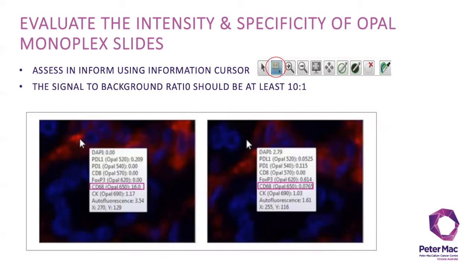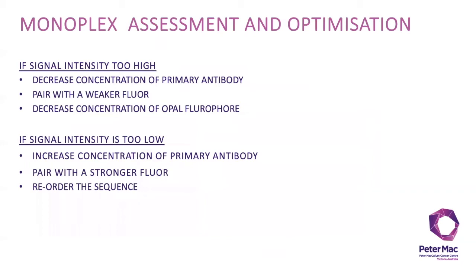When assessing the intensity and specificity of your Opal monoplex slides, use the inForm cursor shown in the images here. Move to an obviously positive cell and note the signal. In optimized assays, signal intensity on appropriate positive control tissue should fall in the range of 5 to 20 counts for all targets. Then move the mouse cursor to an area of non-specific staining and note the signal — the signal to background ratio should be at least 10 to 1. If signal intensity is too high, we recommend firstly decreasing the antibody concentration or pairing it with the weaker fluorophore. If this isn't sufficient, you may want to decrease the concentration of the Opal fluorophore. Conversely, a weak target signal can be improved by increasing the concentration of the primary antibody, pairing it with a stronger fluorophore, or alternatively moving the target to the end of the staining sequence as some epitopes become more accessible after extra cycles of antigen retrieval.